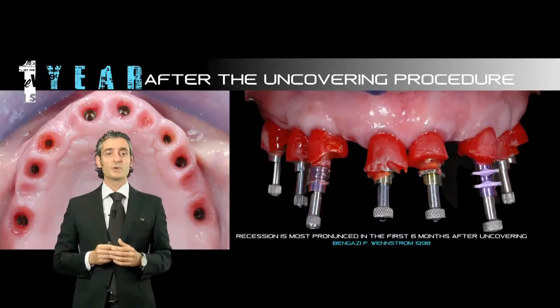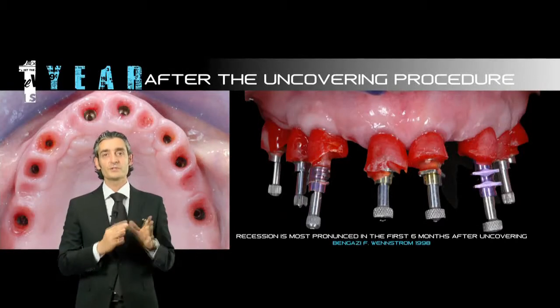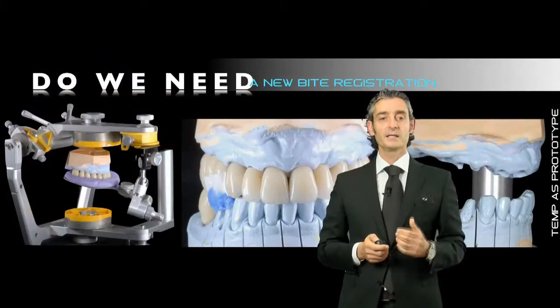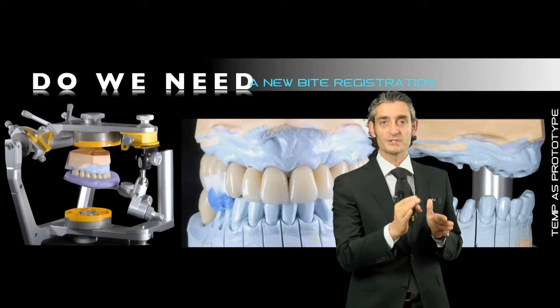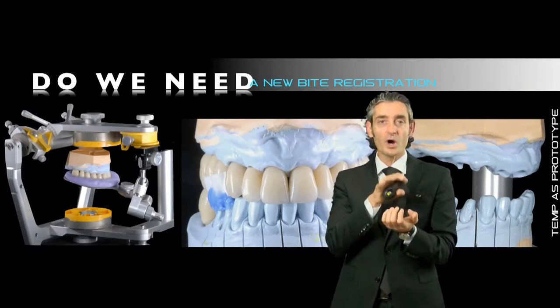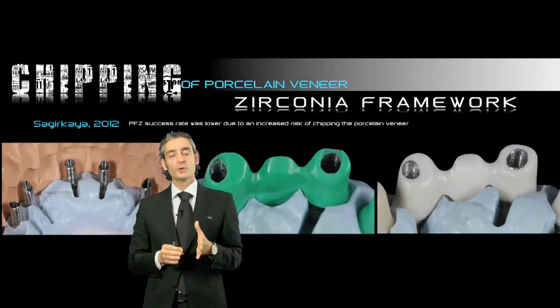And this was 1 year after the provisional restoration in the mouth, in the way to have the maturation of the soft tissue, as you can see here. And this was the way to transfer the bite registration. So we didn't take another bite registration, we used the provisional restoration in the way to maintain and to copy exactly the situation. Look at here right now.